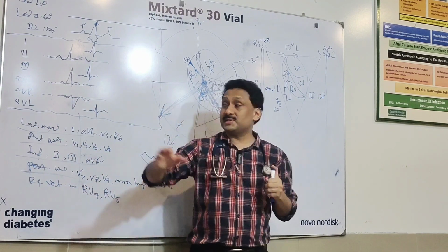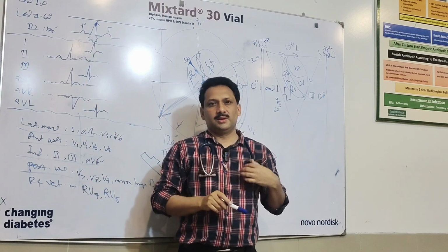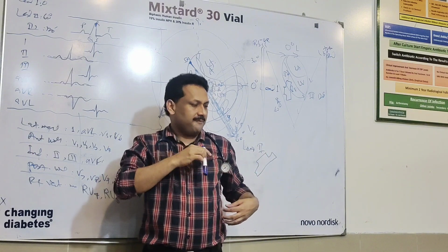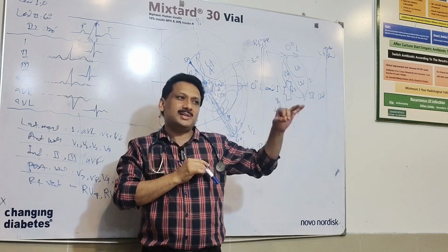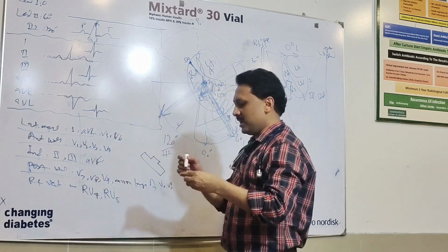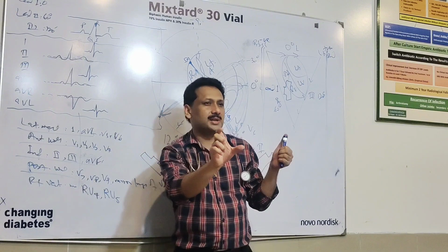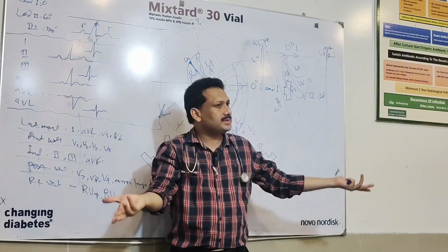In the 6 chest leads, as I have drawn these leads, the thing is very simple. I have told you how to place these chest leads. If you ask me which lead among these 6 chest leads is exactly in the direction of the cardiac axis, that is lead V6. Which of these leads would be having nearly all positive? V6.